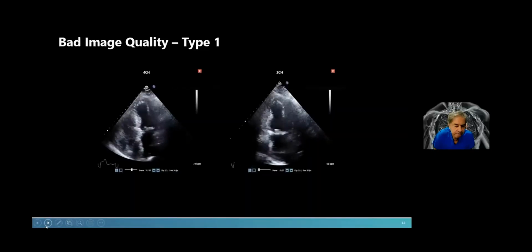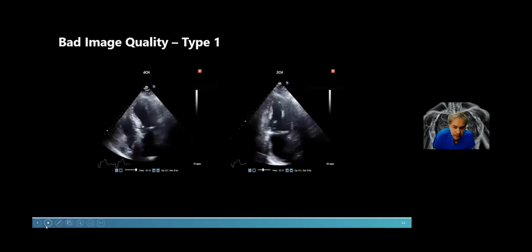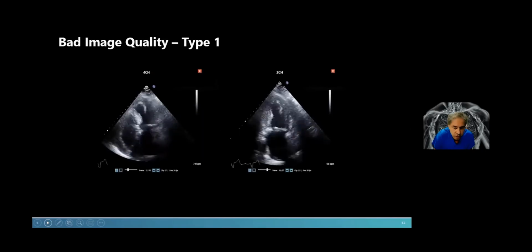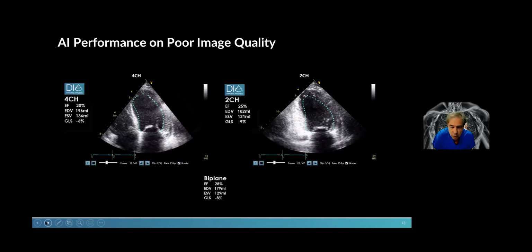Yeah, that's a great question. If we look across all echocardiograms, we probably have a number that are really excellent. We have some in which, like this one, we don't see the endocardial border that well, and we have some which we can hardly see the heart through a snowstorm. And what's very nice, if you look at these images, is that the endocardial border may be difficult to see, but DIA, using its artificial intelligence, can actually trace the borders automatically. And then we, as the interpreter, can determine whether those border designations are accurate or not. So that's very, very helpful in salvaging a technically difficult echo.